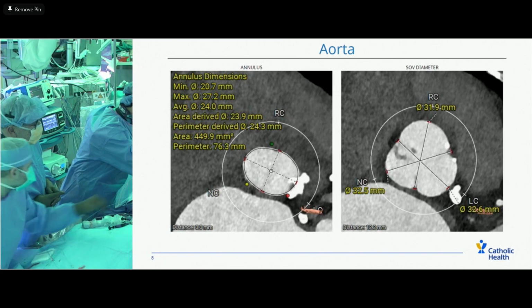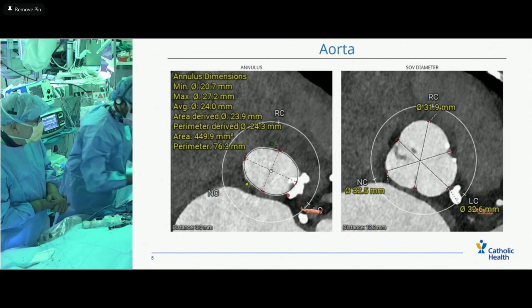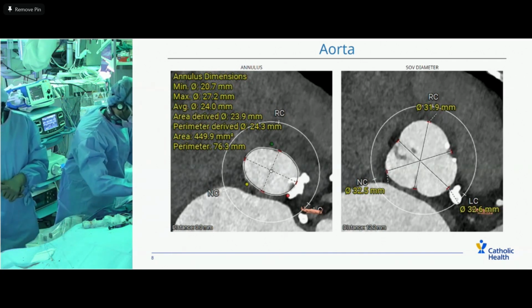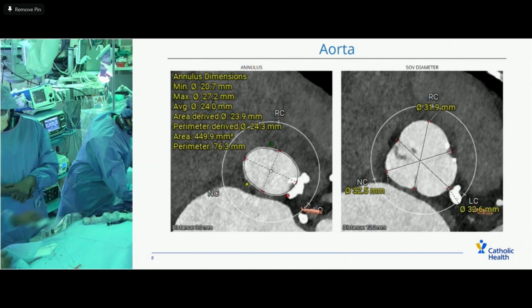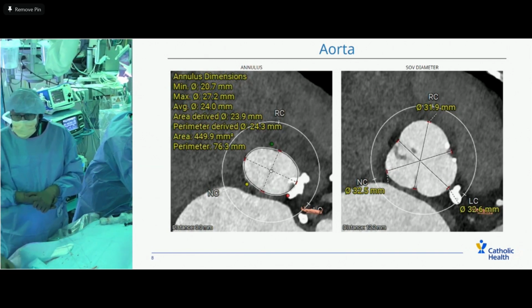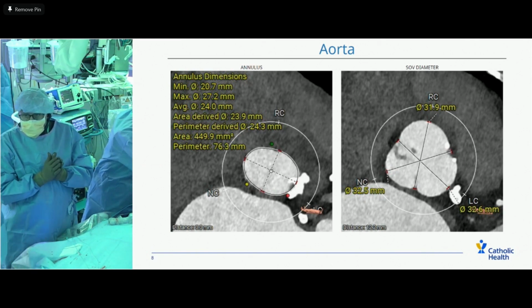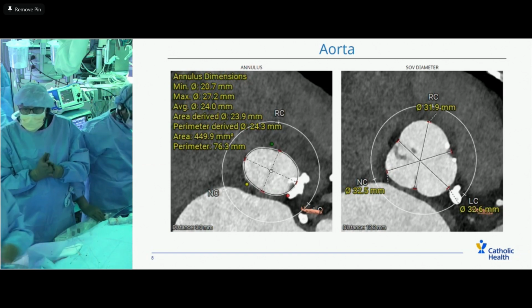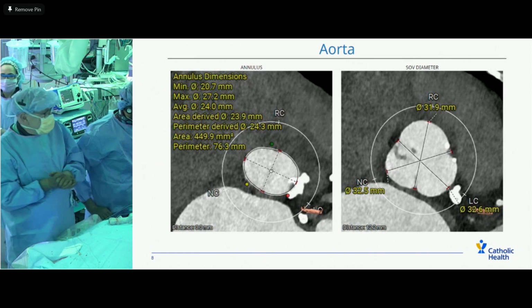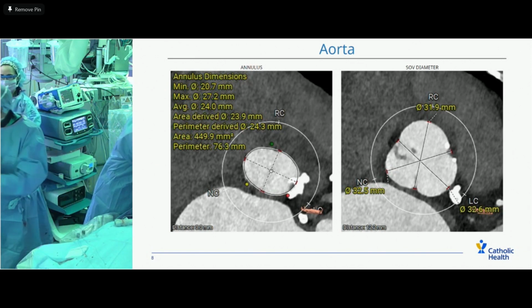One of the advantages of the self-expanding valve is that we can deploy it and not have any real trauma to the annulus. If we have aortic insufficiency, we'll have to pick a balloon on the conservative side. So the measurements that are shown there are a minimal diameter of about 21 and a maximal diameter of about 27. So I would err on the side, if we have to post dilate, of a 20 or 21 initially, just to play it safe.